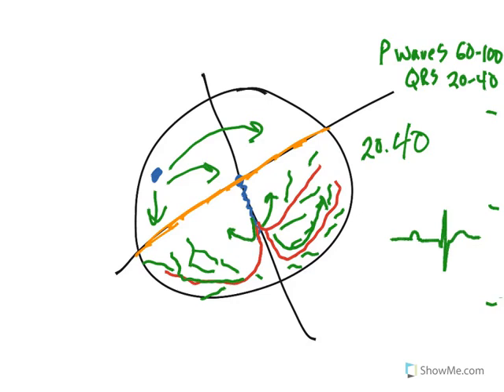And I just want to make sure that you understand that the P wave really has nothing to do with this, okay? The P waves are going to be there, but they're just firing off. They're doing their own thing. So that's why sometimes you can see a narrow third degree, because it does actually fire. It's what we would call a high nodal block, and so the block is maybe somewhere up in this area here, okay? And so there's your block. Then depolarization actually comes from the lower portion of the bundle of His, but then follows its way down and out those bundle branches. And so it actually travels in what looks like a normal pattern through the myocardium at that point.